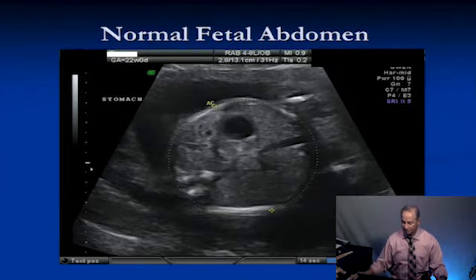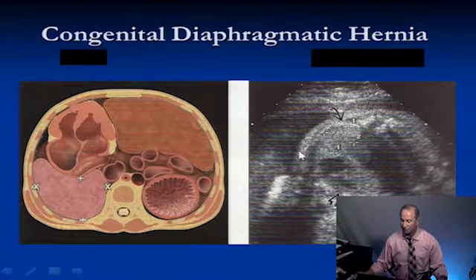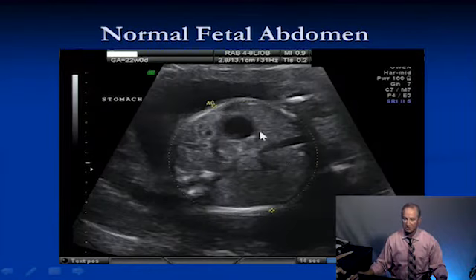You need those measurements. When you do your abdomen circumference, there are certain landmarks that you will see. You have to see a stomach bubble, or the stomach itself. You have to see the umbilical vein coming into the abdomen here, and you see the left portal vein here. Okay. So if you don't see this stomach, then what's going on? What are the possibilities? Give me 3 possibilities.